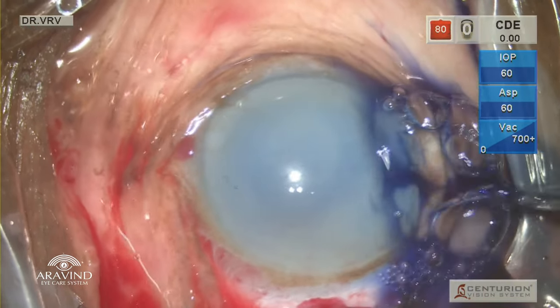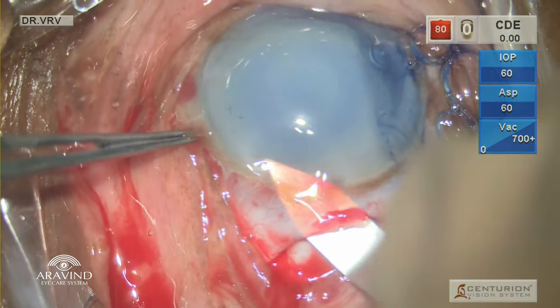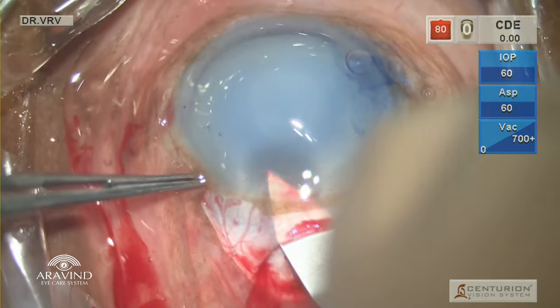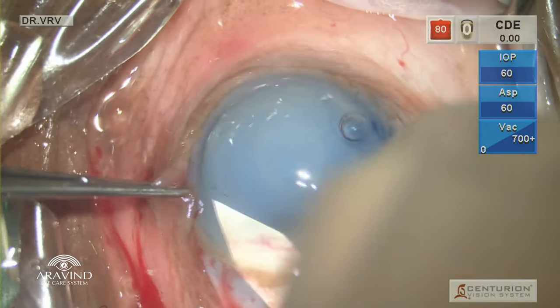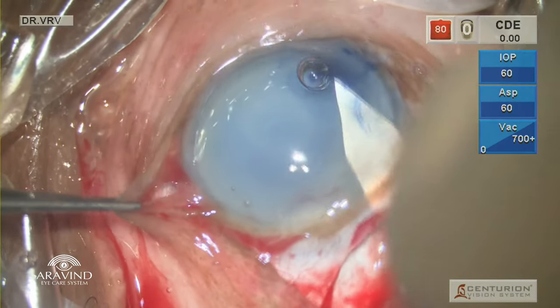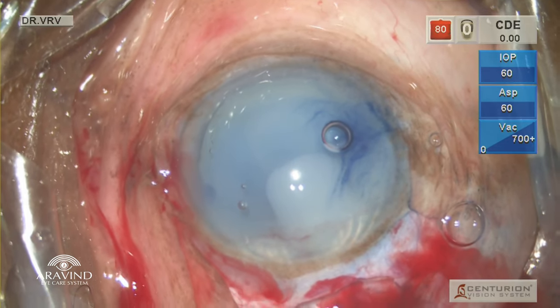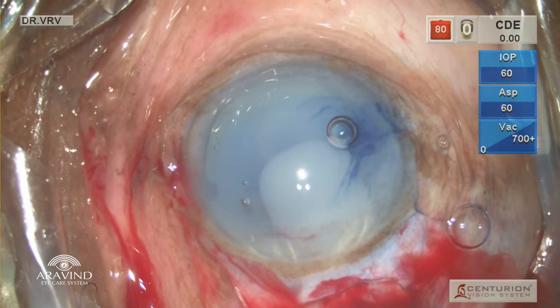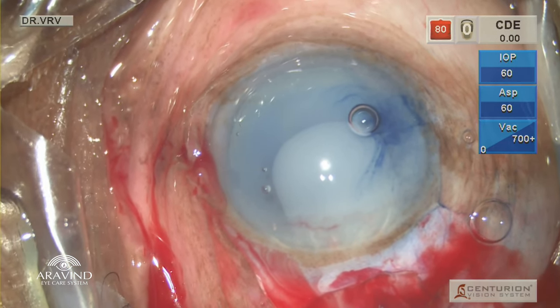Using a bevel down keratome, placing it sideways at the external lip and turning as you go inside, a dimple is created and with forward movements, the left side of the tunnel is entered and the same is done at the right side. And using the same keratome, the anterior lens capsule is pierced so that you have a larger opening in a single go, so as to prevent the Argentinian flag sign.